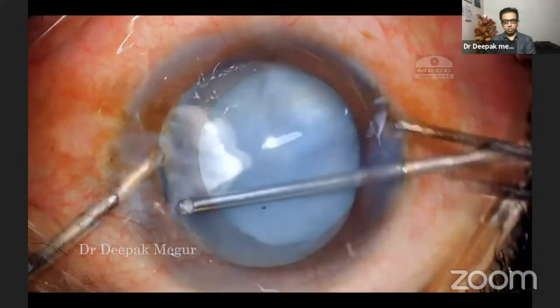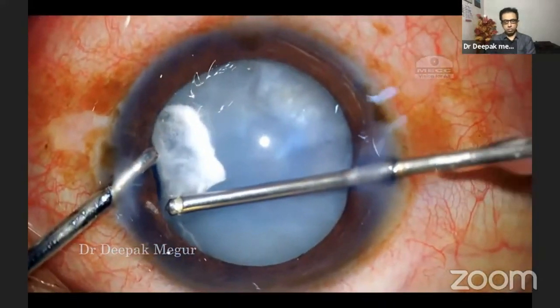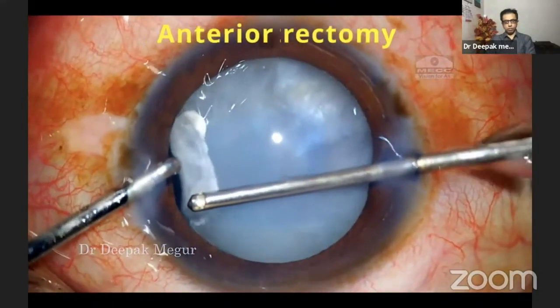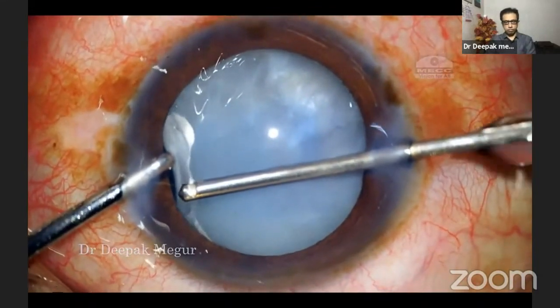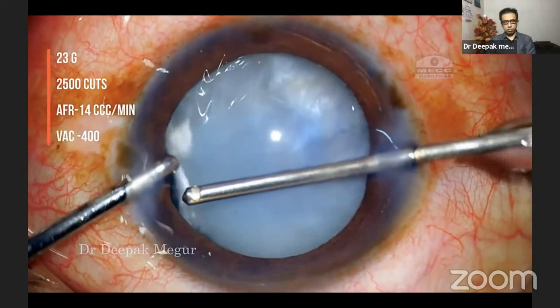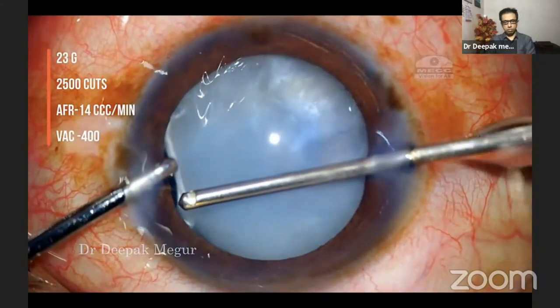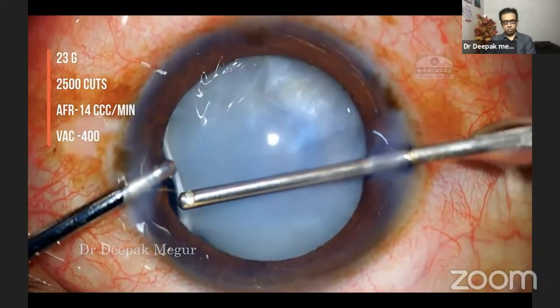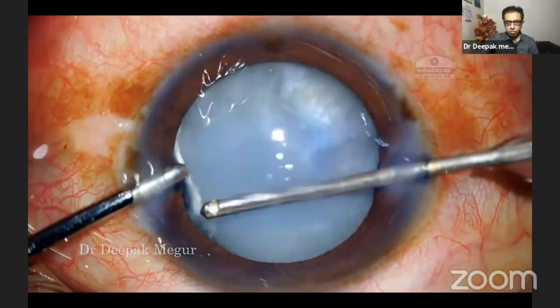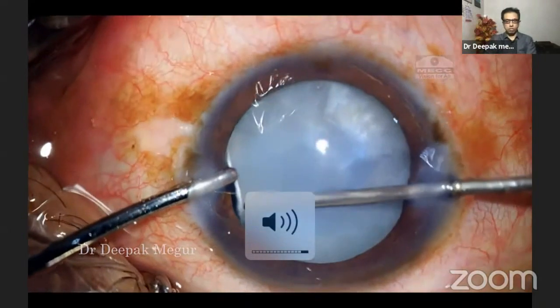The first thing to do in such a scenario is to ensure that we do anterior vitrectomy and remove all the prolapsing vitreous. We can't proceed with the vitreous prolapsing out like this. So using a very low flow rate and high cut rate, I'm doing anterior vitrectomy to ensure the vitreous is cleared off. The high cut rate and very low flow rate ensure that we don't damage the iris or the anterior capsule.